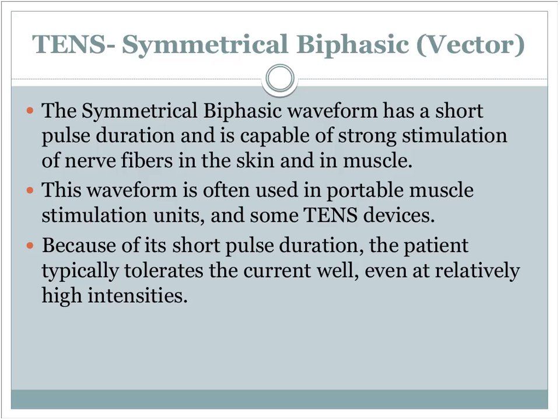But this is such a basic, simple waveform that you don't need a big, complex machine. That's why there are all these little portable handheld TENS machines out there, which nowadays, I mean, it's almost like anybody can purchase one at the drugstore for like $50. Whether they work effectively or more effectively or not, I haven't seen any research to say that they do or they don't. But it's a very simple waveform. And it's pretty effective in reducing pain. It's almost like distracting the person from the pain so that they can perform activities.